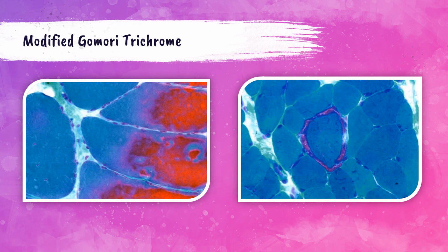The photo on the left-hand side of this slide shows a muscle biopsy specimen that's stained using the modified Gomori technique. This biopsy was put in formalin briefly, and this causes the staining pattern to be affected. The photo on the right-hand side of the slide shows a ragged red fiber in the center of this modified Gomori technique stained tissue. This indicates a mitochondrial disease. Okay, so that wraps it up on enzyme histochemistry.